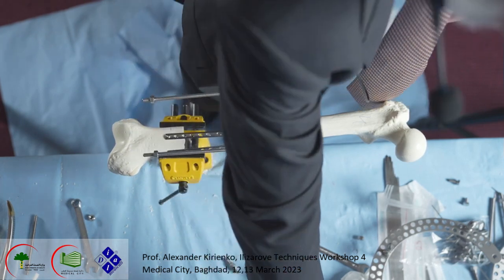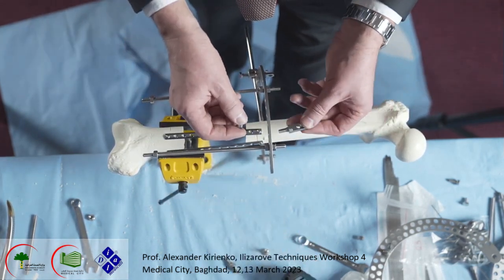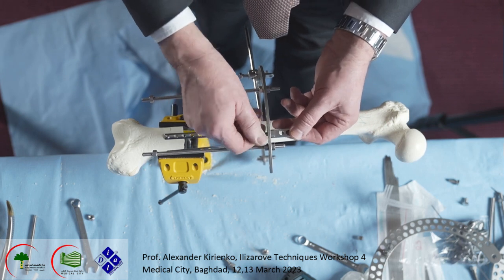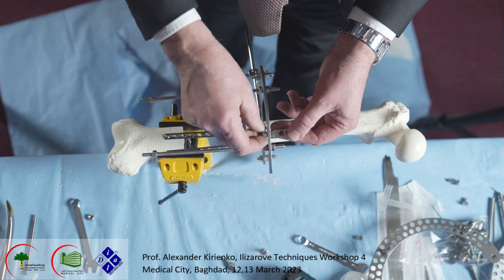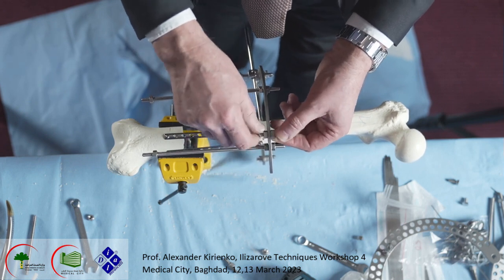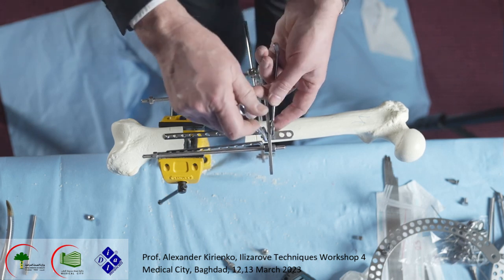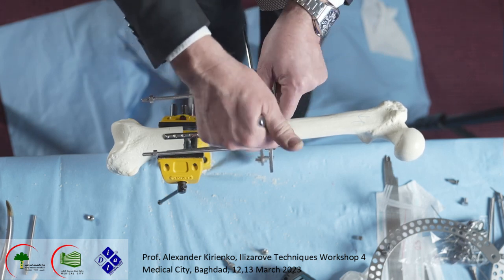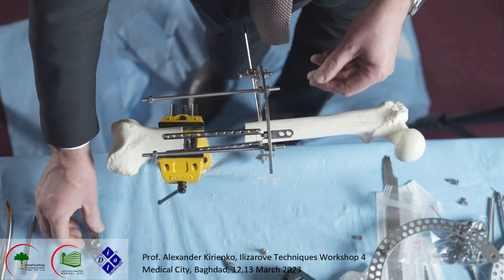with the hinges. In this case, we should build biplanar hinges because the first thing I want is to control the varus deformity. Another thing, to control the procurvatum deformity during lengthening. What I do, I put these hinges a little bit higher because it should be done at the level of the osteotomy. One.